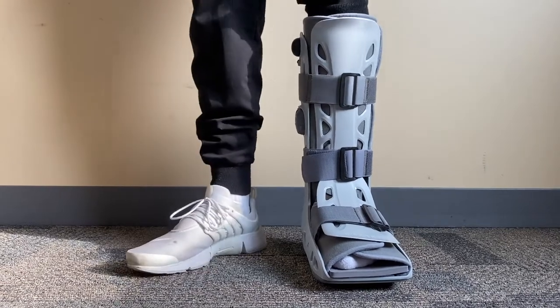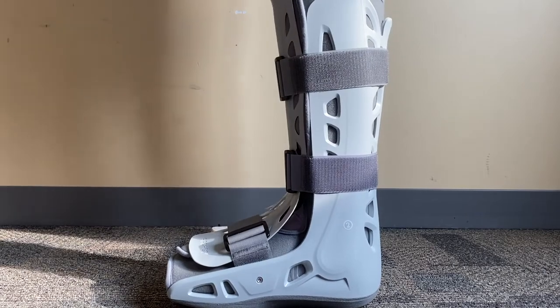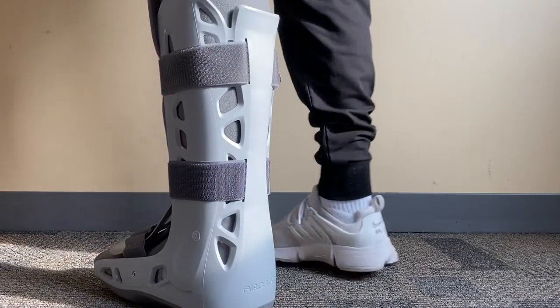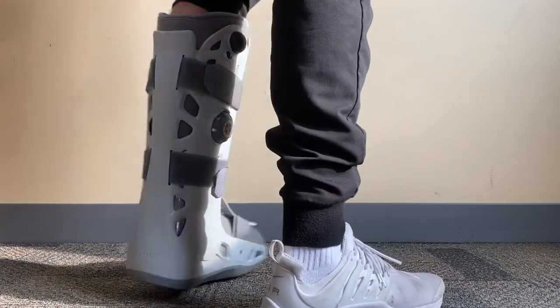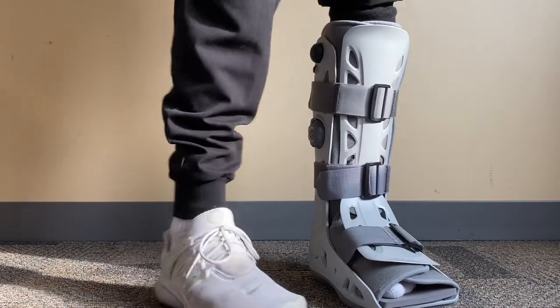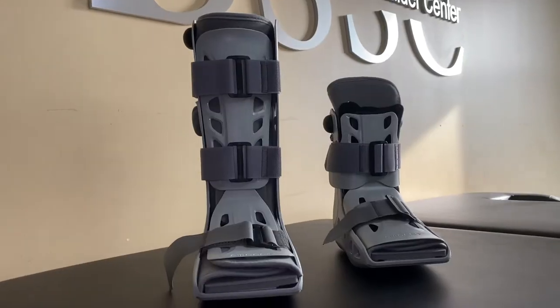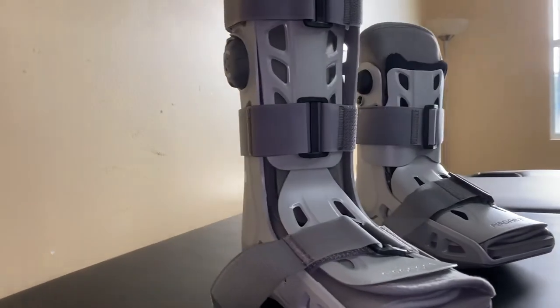The boot may be walked in at the discretion of your provider or may be utilized for non-weight-bearing purposes such as immobilization. There are many alternative models and brands available, but generally boots function the same. Boston Sports and Shoulder Center bills this durable medical equipment item to your insurance company. Please contact your insurance company for your benefits or contact our office for additional information.